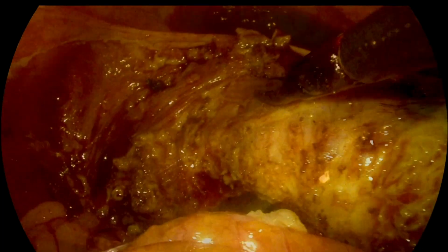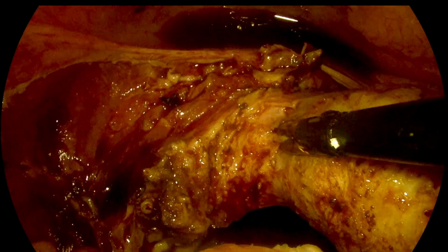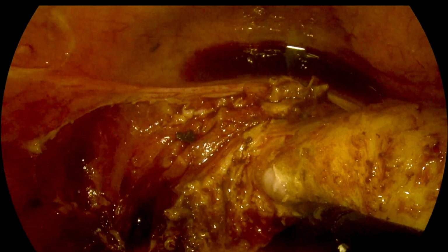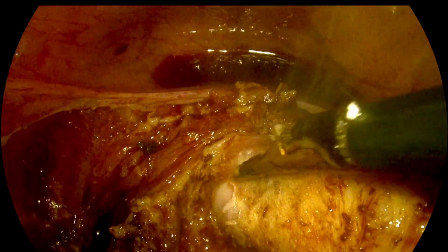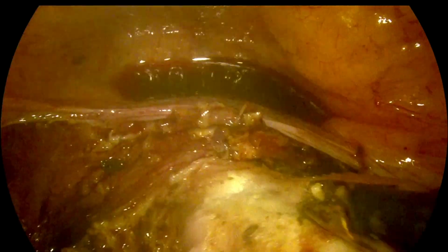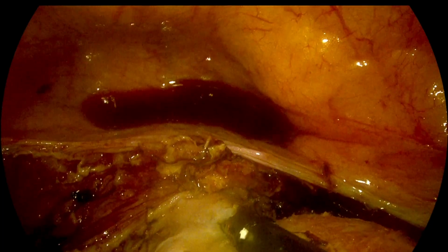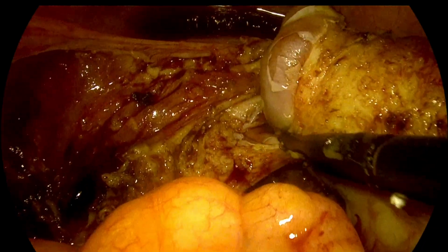Now the job that is left is just to divide the cervix from the vagina. We can see that initially we had already opened the vagina on the left side. So we are going to complete the process of transecting the vagina from the cervix. That is the vagina. We are going to separate it, and then divide it, completing the transection using a LigaSure, a bipolar sealer. We are using it.